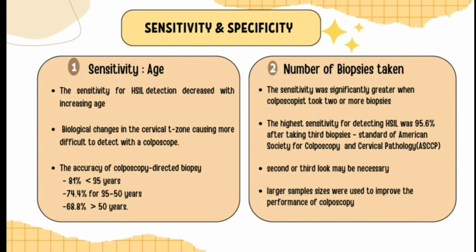Therefore, second-look biopsies and perhaps even a third biopsy may be necessary to ensure we do not miss opportunities to intervene, and future studies using larger sample sizes might be conducted to improve the performance of colposcopy based on stratified patient risks.